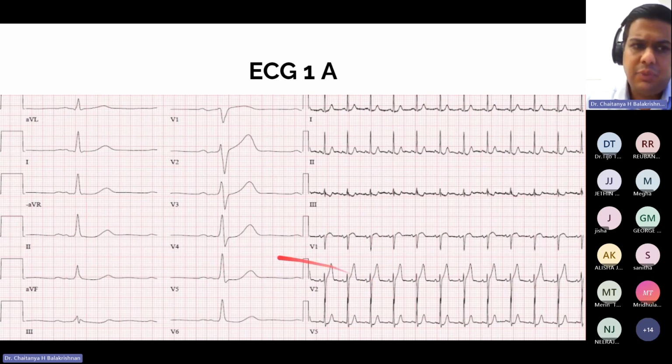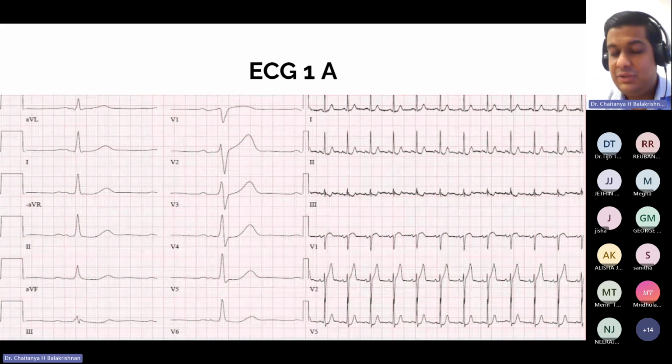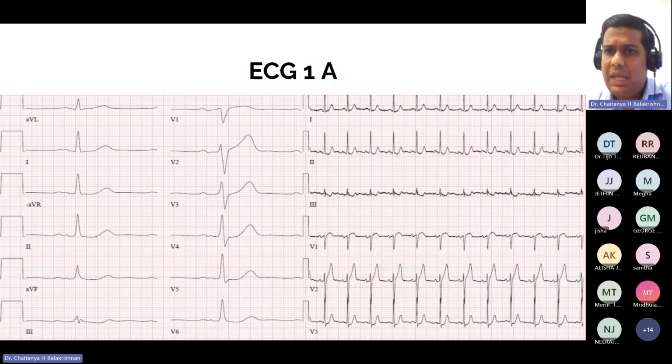This is useful to widen it when you're dealing with an arrhythmia, and Alex will come to that eventually. When you're dealing with certain types of arrhythmias, when the heart rate is so high, it's sometimes difficult to interpret what's going on unless you stretch out the ECG. So people often do a stretched out ECG just to look at the waves, especially the morphology of the QRS, to look for a hidden P wave and to look for the morphology of the T wave.